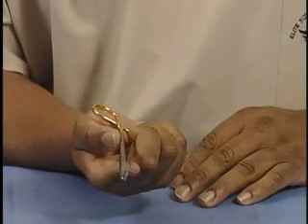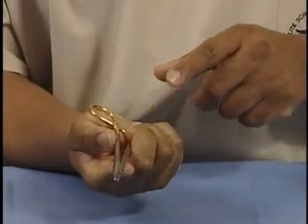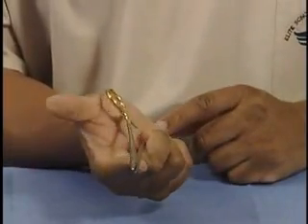To open and close the needle driver using this method, push towards the palm with the pinky, ring finger, and middle finger, and oppose that pressure with the pad of the thumb.